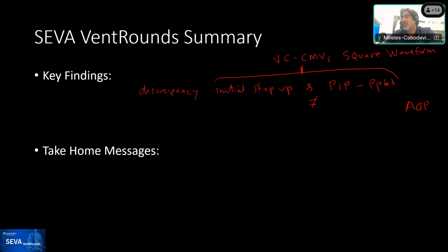But it's a diagnostic maneuver that you can do, and it has been described in the literature. The author's name is escaping me, Handeberg, and I'm butchering her last name, but it's a very nice article describing this maneuver that you just saw as a diagnostic mechanism, especially when you don't have a volume pressure loop.